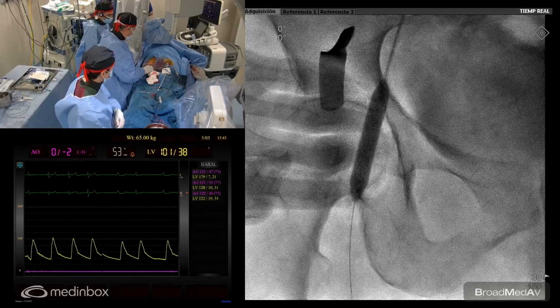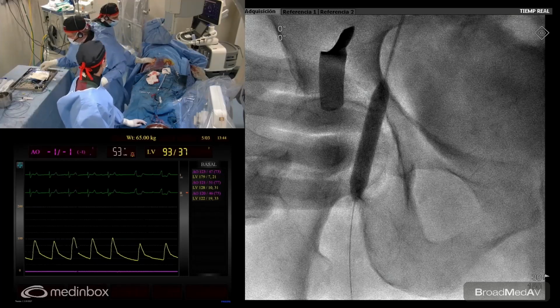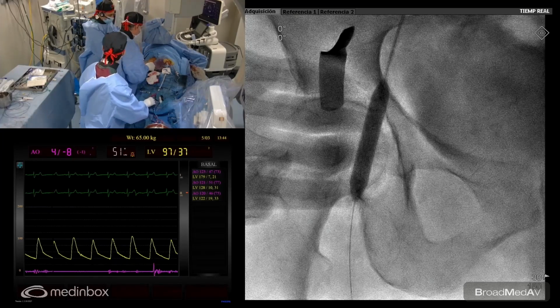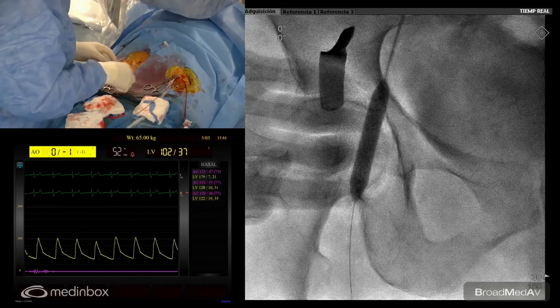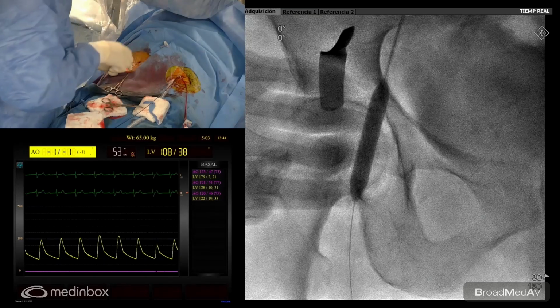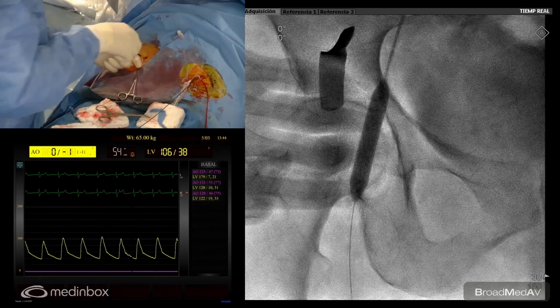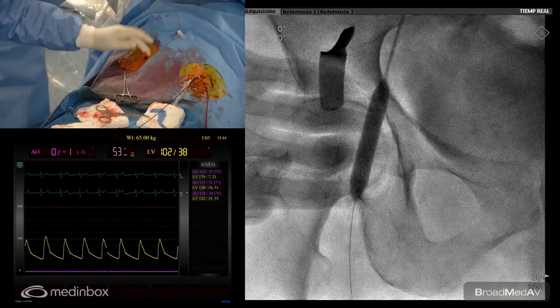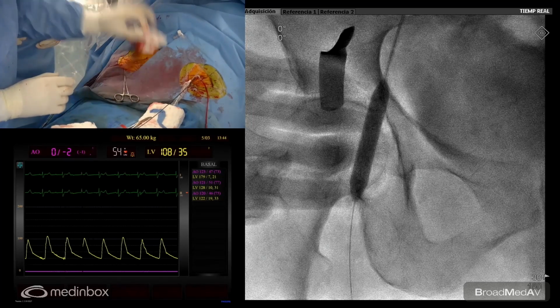Now we don't have bleeding. That's good. But anyway, we still have the balloon. We can push all the sutures again, just not to move anything else afterwards. This movement of the first proglide probably damaged the intima, and that's why we still have some bleeding. And that's why we are going to hold the groin for probably 10 or 15 additional minutes in case we have bleeding. So I think, Jaime, you need a little bit more protamine to do an ACT.